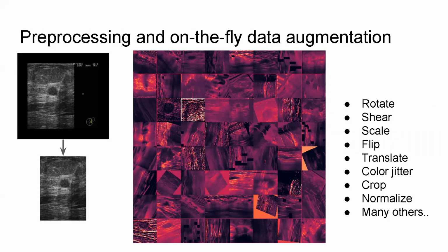But the training data was heavily augmented using the imgaug Python package. And this is just because I have a very limited data set. I want to make the most of it, make my algorithm very robust.